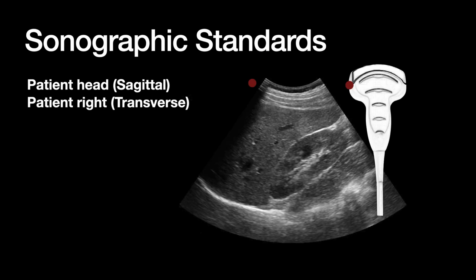So now that you've formed the image, let's take this to the bedside and talk a little bit about how we actually use this, right? It's important that we have a standardized way to create these images so that those who come behind us and see these images can understand them and we can reproduce these images.